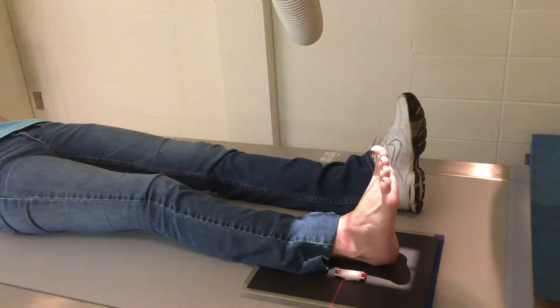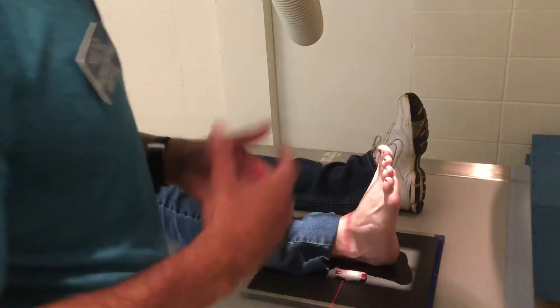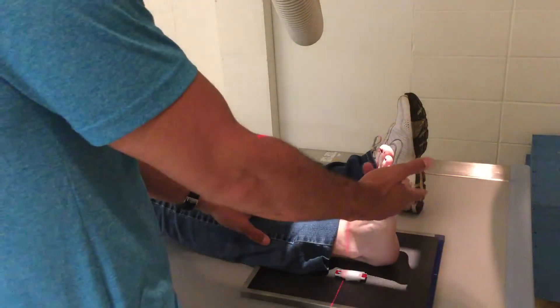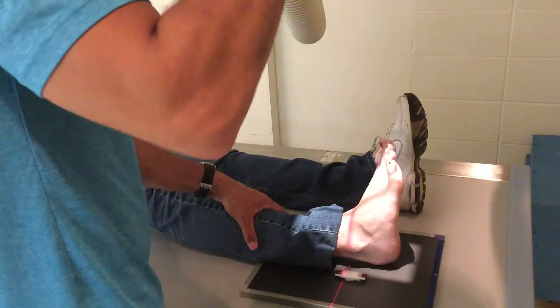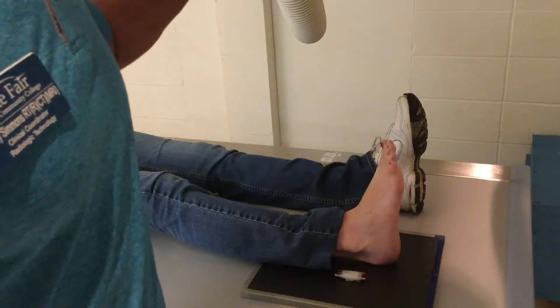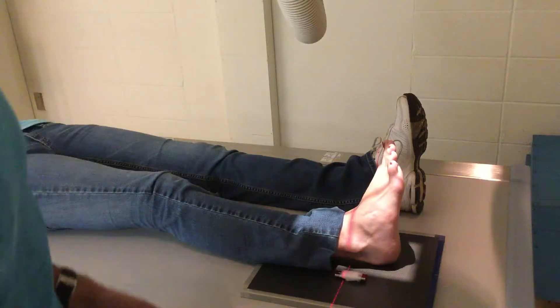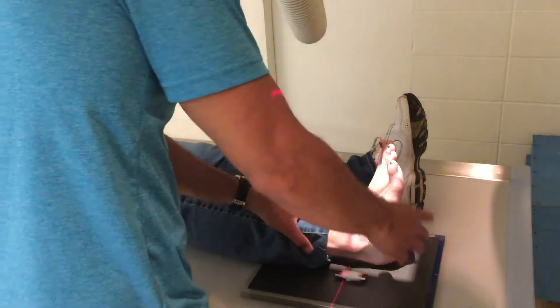Then you do an oblique. Your text is going to talk about two different types of obliques: one is just your 45-degree medial oblique, and the other is called your mortise. You'll hear it said different ways. We typically do the mortise because it shows the tibial-talar articulation really well. You dorsiflex again and then roll in 15 to 20 degrees. Typically, when you center on the joint, your crosshair is going to go straight through the pinky toe and through the joint — that's a pretty good gauge for 15 to 20 degrees on most people.